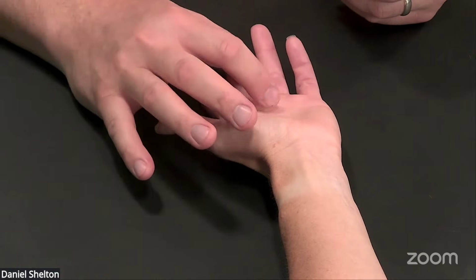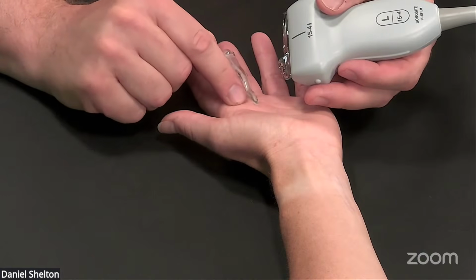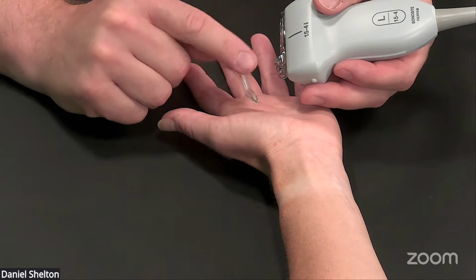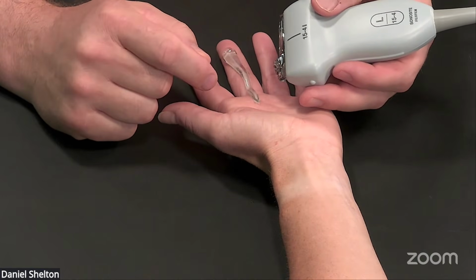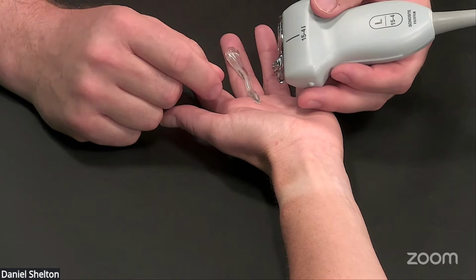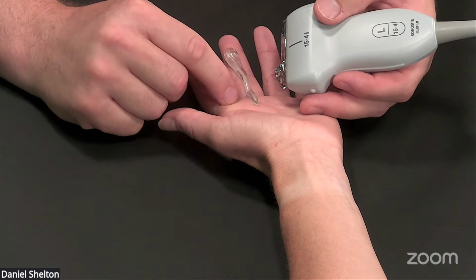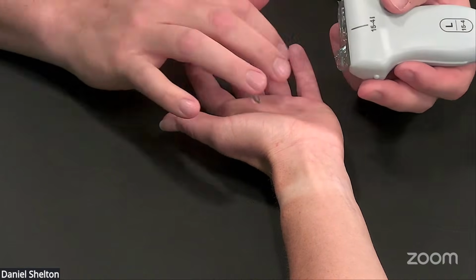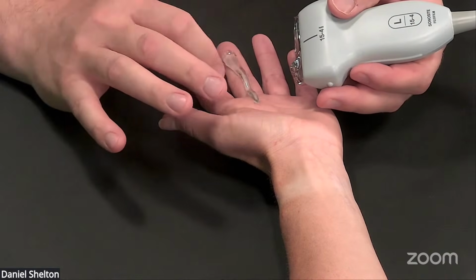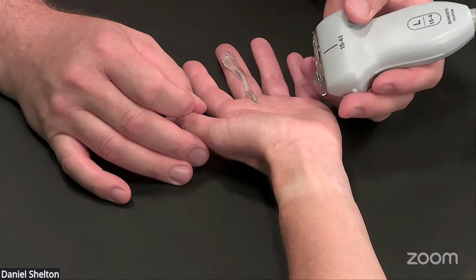So I'll start with the A1 pulley here on the MCP joint side of the hand. Dry skin is full of air cells, and air is the enemy of ultrasound. So if you've ever seen an abdominal ultrasound where gas gets in the way or lung sliding, you see what air can do to an ultrasound beam. Keep that in mind at the skin level, just like you're doing the heel and the foot. For plantar fascia, you want this type of skin here to be as moisturized and debrided of any callus or anything before you get started, just to give yourself the best shot you can.